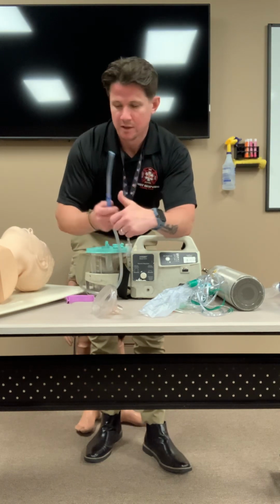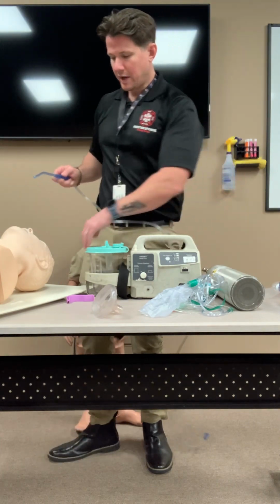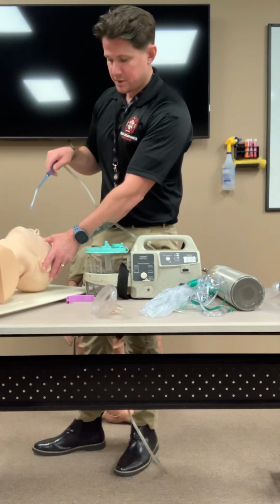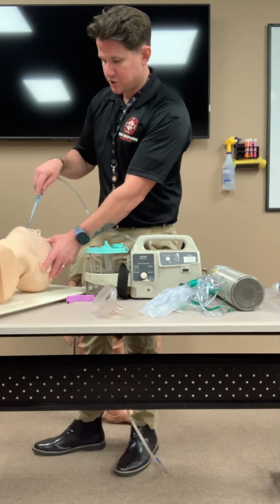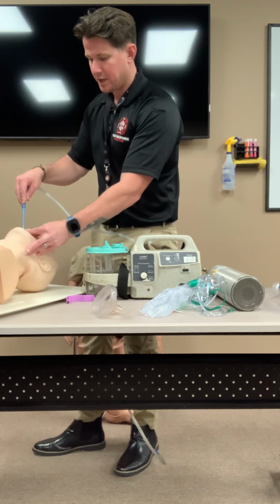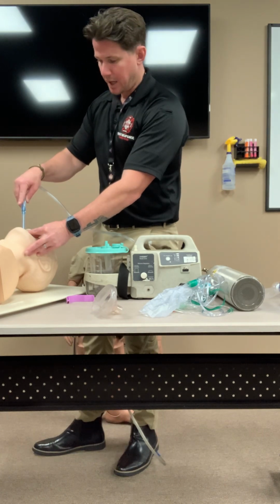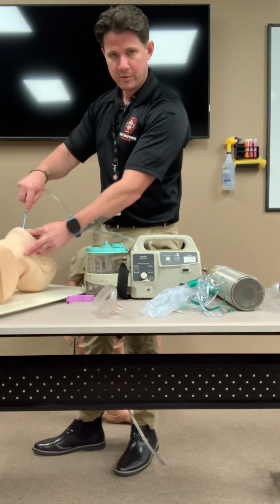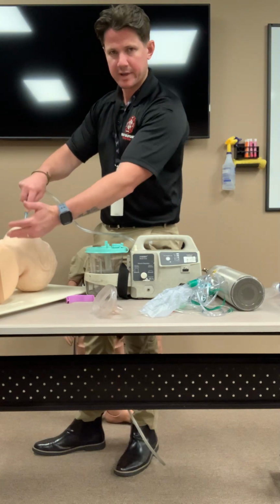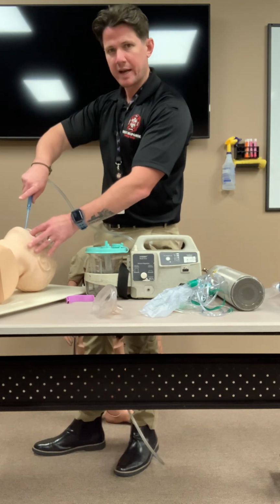Awesome, right? So now for my patient that needs suctioning, the cue here is I'm going to insert the suction catheter into their oropharynx just as far as I can see the tip of the suction catheter. I don't want to go any deeper. When I can no longer see the tip, I'm going to cover the hole. Remember, we enter the mouth without covering it. We don't want to suction as we're going in. We wait till we get in as far as we're going to go, then we cover the hole and suction as we pull it out.